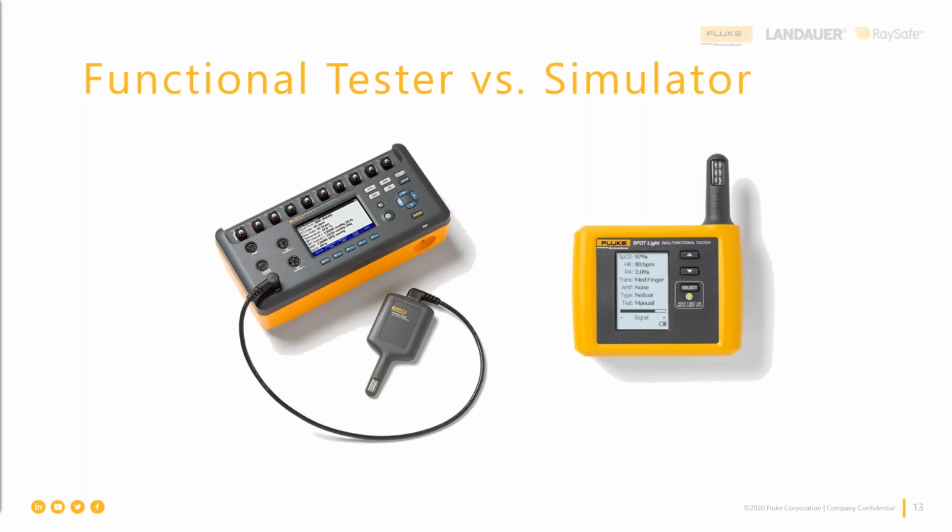Yeah, I just want to add something here. It's impossible to make a real human finger because a human finger is so complex. It's not just the hemoglobin. There are all other tissues there. This is why there is no such thing as a human pulse simulator. It's just a function tester. No, it's a great point. And as we get through a little bit of the variability that we're able to do with these functional testers, thinking about how to make that human finger becomes more and more impossible.